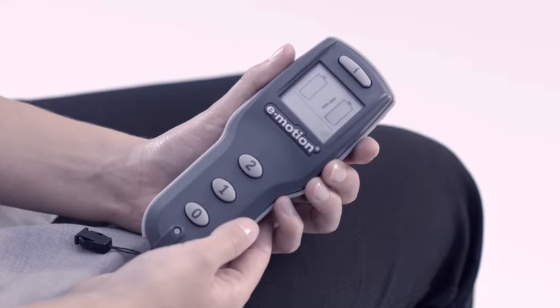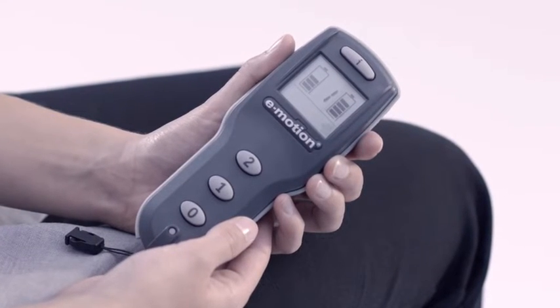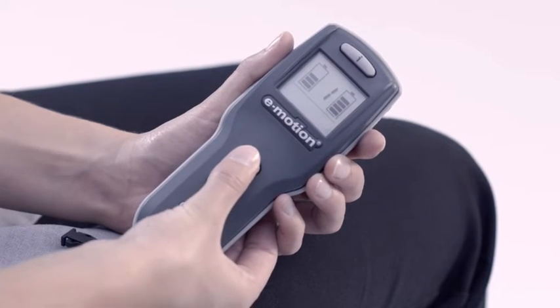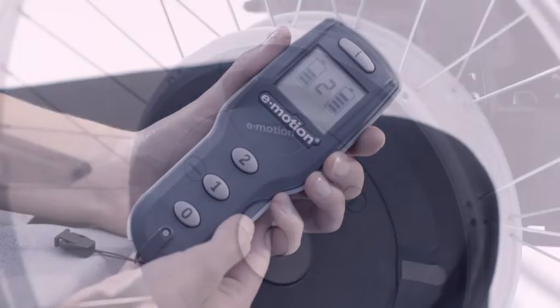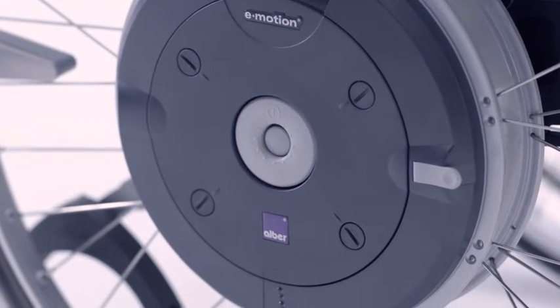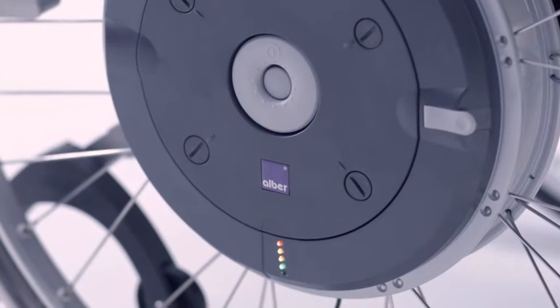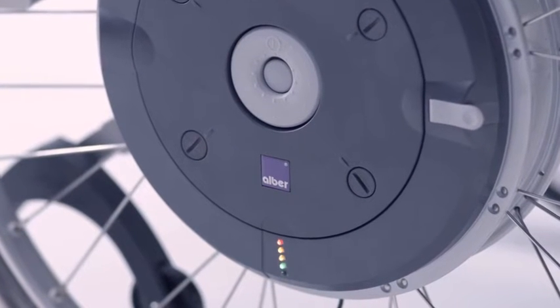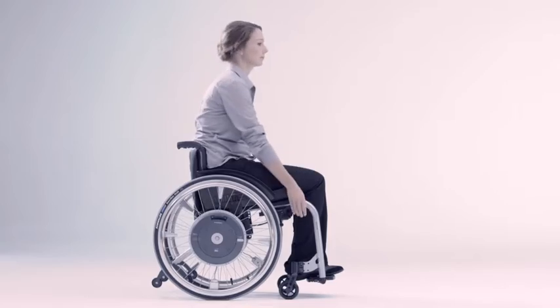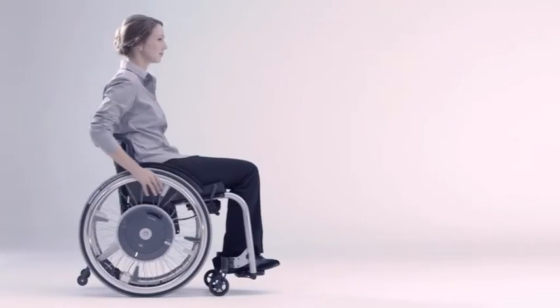eMotion is switched on and off using the remote control. Two selectable power levels can raise or lower the thrust of the motor. eMotion can optionally also be switched on and off on the wheel if required. The battery monitor reliably informs you about the current battery status. The power is increased via the push rim as required.